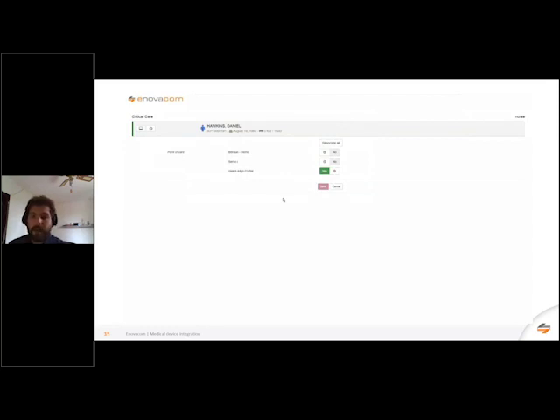If needed, she can come back to this window, and two buttons are available on the left side of the patient. The first is a clock corresponding to the frequency rate, to the frequency of the data retrieving collection. So you can change it as you want. All this information is previously chosen by the nurse. And the second button, the screen one, refers to the direct vital sending. It means that if the nurse clicks on the button, the last received data are sent to the EHR.